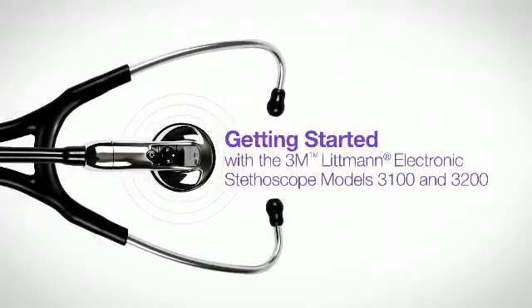This video will walk you through the basics of setting up and using your Littmann Model 3100 and 3200 stethoscopes.